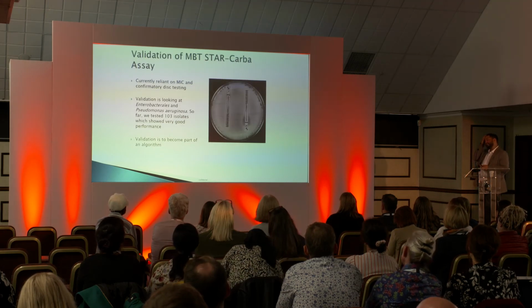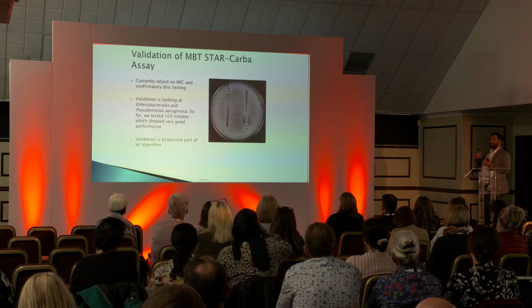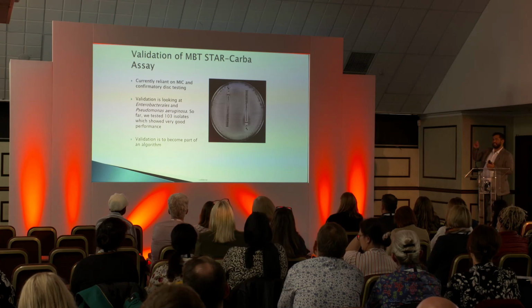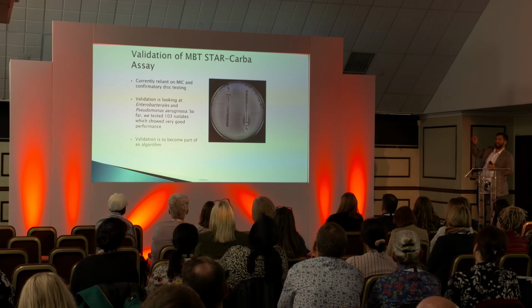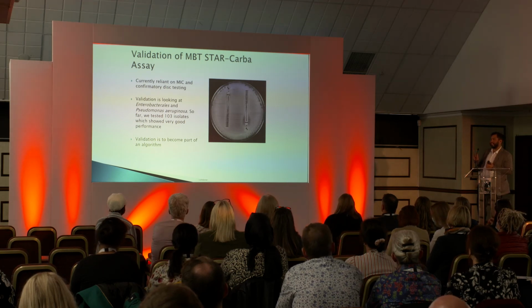So as I've said already, we currently are using a lot of hands-on tests. So we do these things called MIC strips. On that is an antibiotic which is concentrated at different levels. At the top number where the letter is, that's basically the highest concentration. So you can see that the organism on there is resistant to both of those antibiotics because there's no zone of inhibition basically. So that antibiotic's not working, which is quite scary.